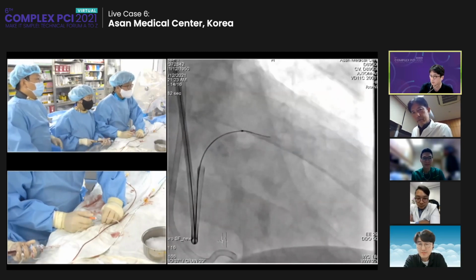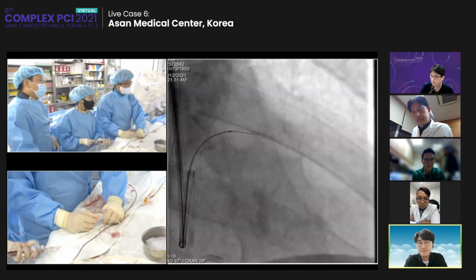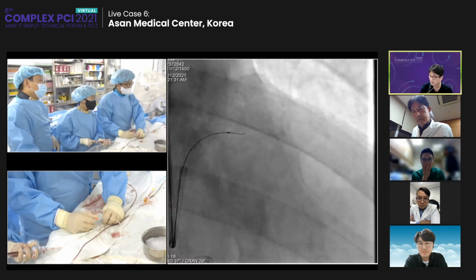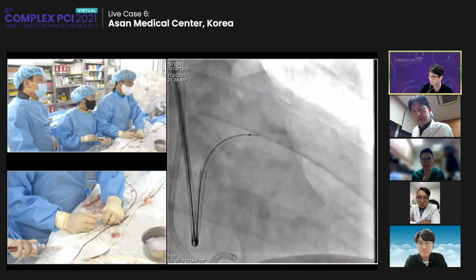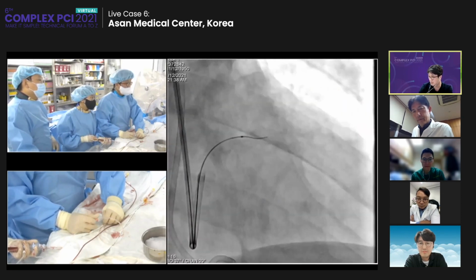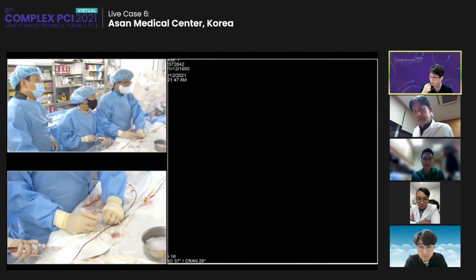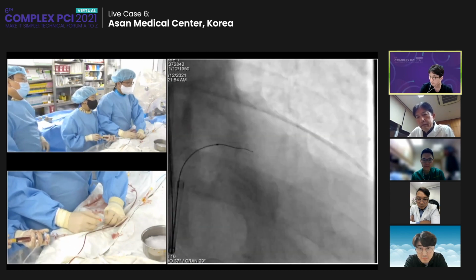The most resistant part was at the distal cap, right? Yeah, and I think that was the point where the wire went outside, maybe, or the initial portion. But at the mid portion of the two calcium, you can see that there is two calcium there, and I think it's good. That's a superficial calcium, so my wire should go in the mid portion of that calcium.